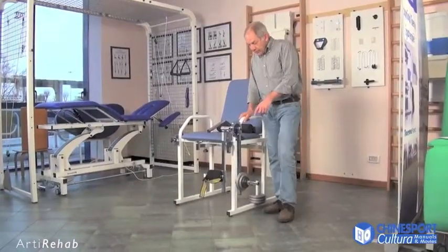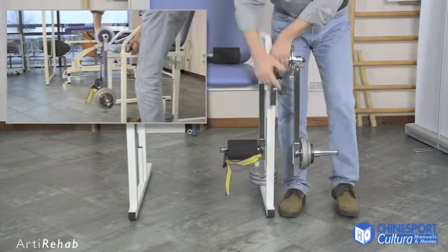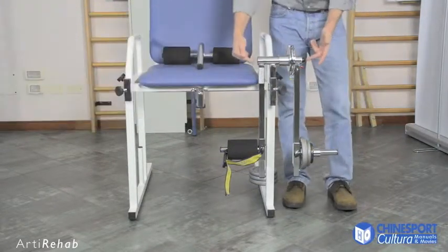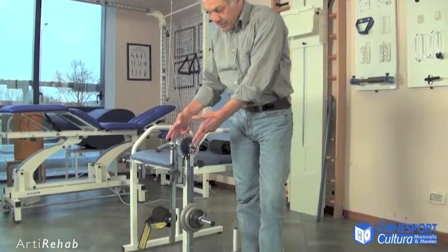The moveable arm can also be adjusted. It can be adjusted in both height and depth so that the rotation axis for the moveable arm can be aligned with the axis of rotation for the knee.